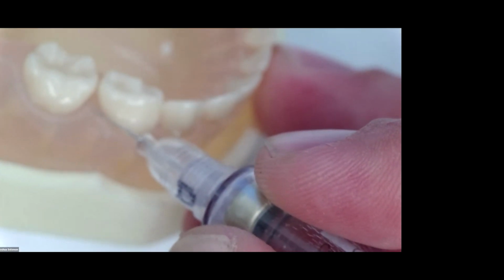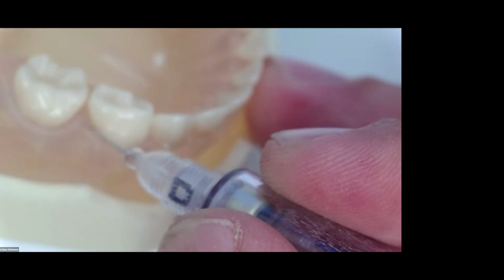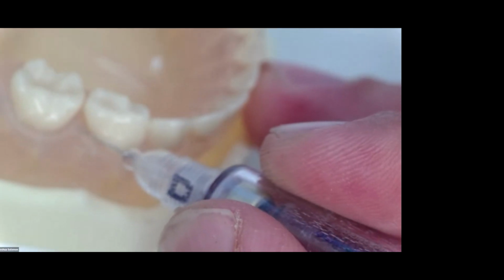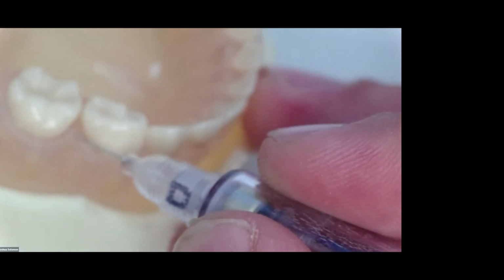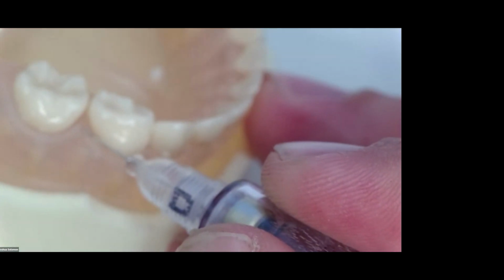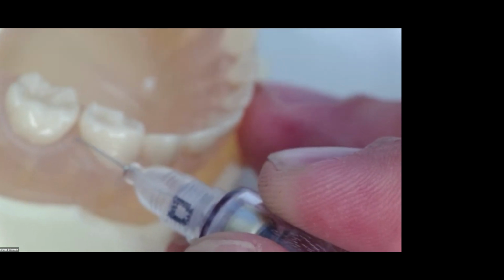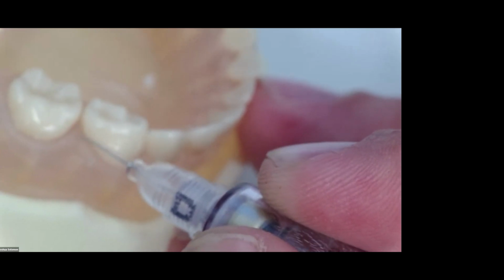This takes about 5 to 10 seconds. It really comes down to, it's not the time that matters. It is how much blanching you see. So depending on the child, depending on blood flow, it may take you 5 seconds, could take you 8 seconds, but I would say on average, it's 5 to 10. Once you finish that first stage and you see that papilla is blanched, and really that blanching only needs to be in about a 4 to 5 millimeter diameter here.